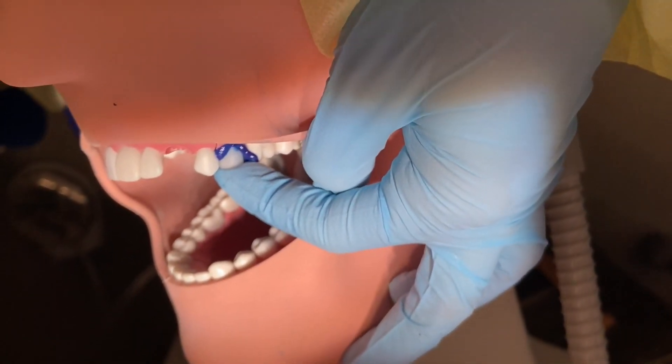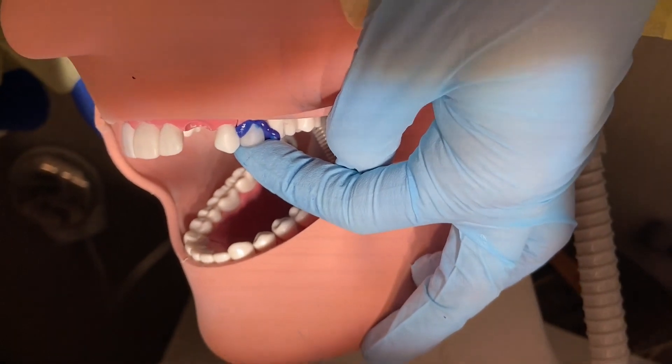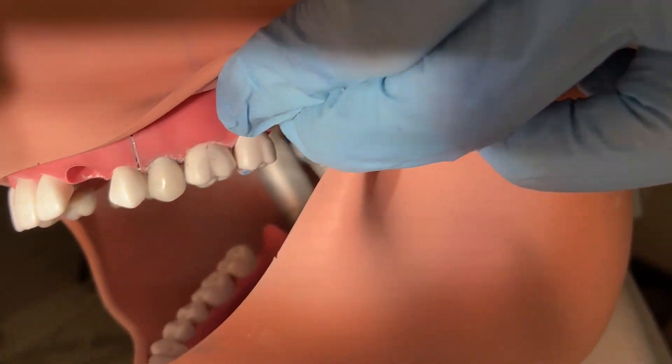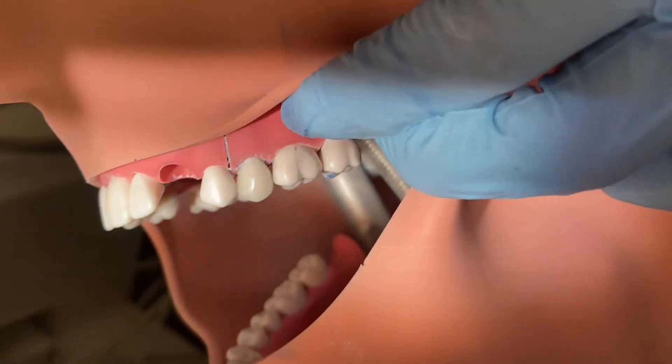After we adjusted it, we needed to do the fit check — and this is the fit check paste. Here I go doing it, and here is a full fitted and polished crown. Look how shiny!